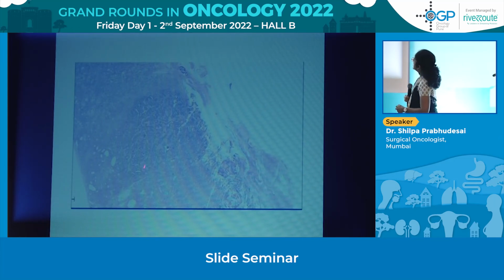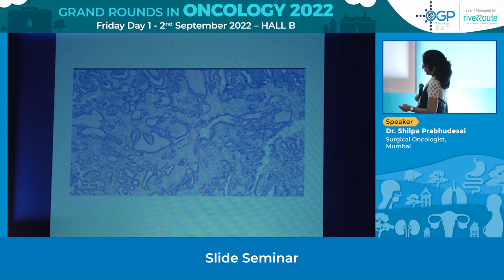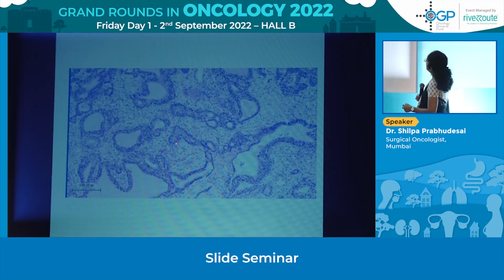At this magnification we can see tumor. Obviously it looks like a carcinoma, perhaps with these gland formations, some papillary structures, and irregular glands with irregular lumina filled with some kind of material. At places they are crowded. The lining appears very stratified. There are these papillary structures, and the cells are columnar. They are tall, columnar in nature. Again, some areas with cribriform pattern.